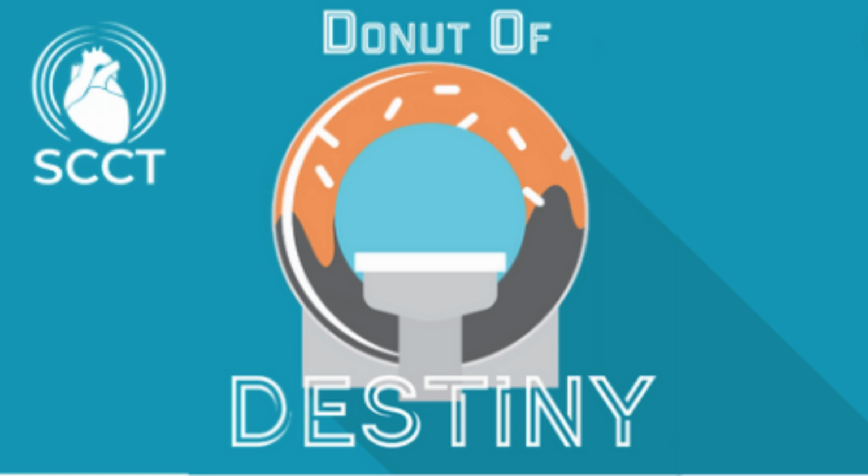If we talk about systole, the first part of systole is isovolumetric contraction, which could have been ideal because the heart doesn't move at all during this time, but this phase is very small, so we cannot target that.